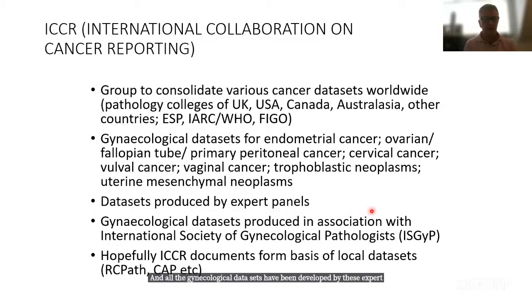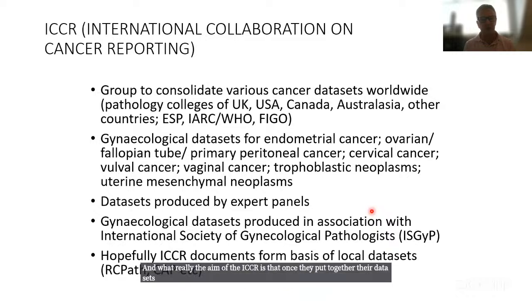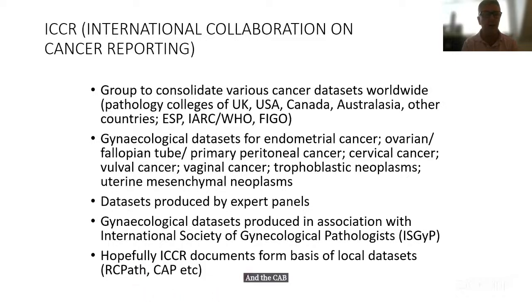The gynecological data sets have been produced in association with the International Society of Gynecological Pathologists. And what really the aim of the ICCR is that once they put together their data sets, these will form the basis for local data sets such as the RC Path and the CAP data set in North America.